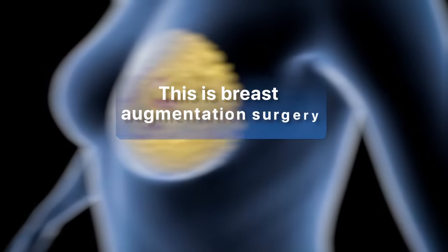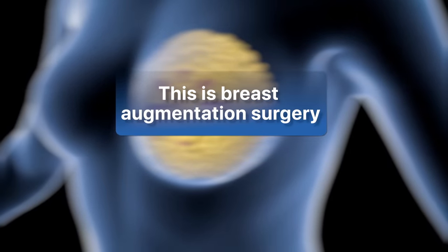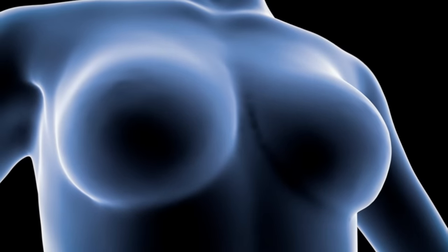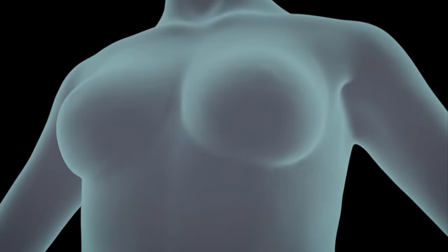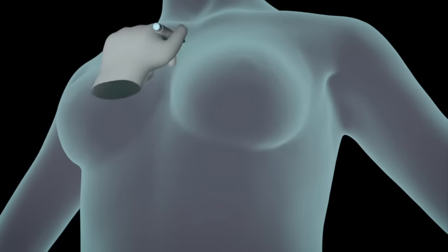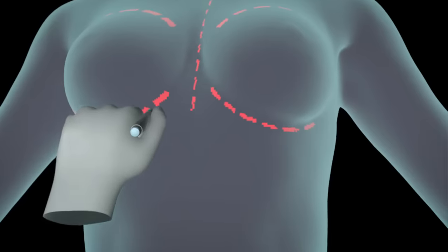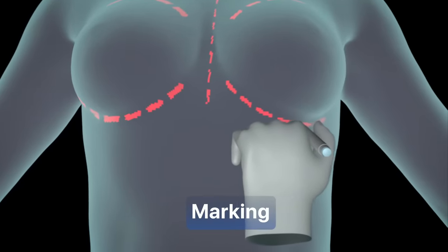This is breast augmentation surgery. On the day of the operation, before entering the operating room, the surgeon will draw marks on your body that will help him know exactly where to make the incision and where to place the implant. This is called marking.